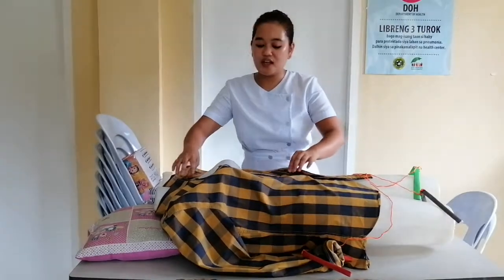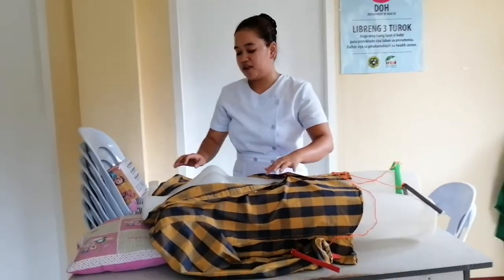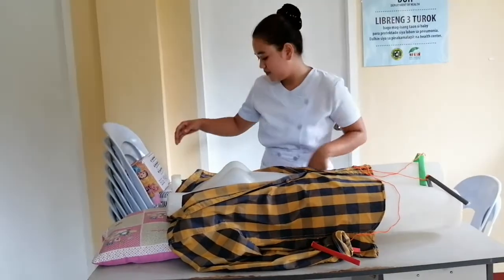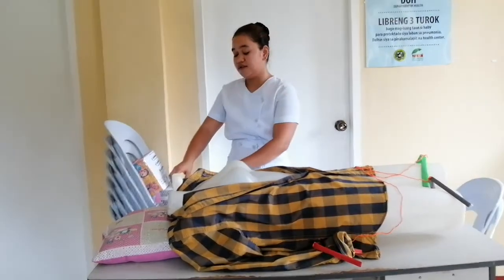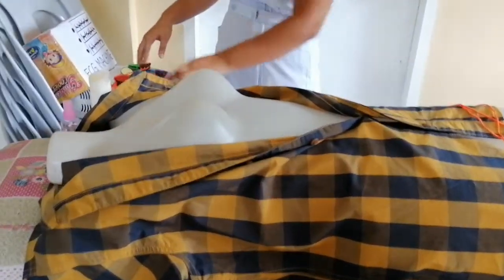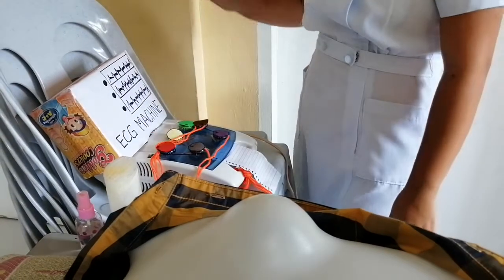But make sure that the curtains or doors are closed to provide privacy to the clients. So here are the 6 leads to be placed on the chest part of the clients with different colors.